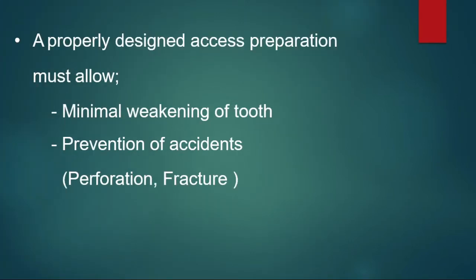So an adequately designed access preparation should allow the following. Number one, it should be very conservative with minimal weakening of the tooth. And number two, it should prevent unfortunate accidents like perforations when locating canals or fracturing instruments when preparing them.